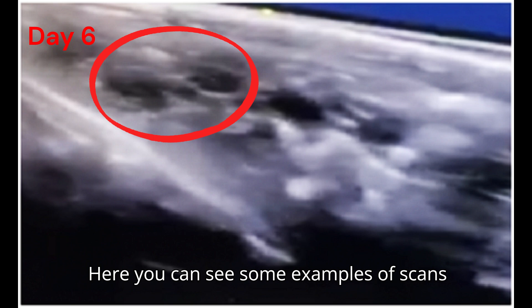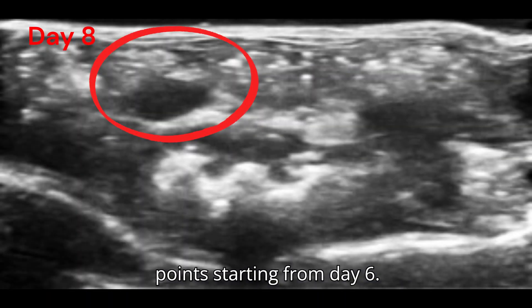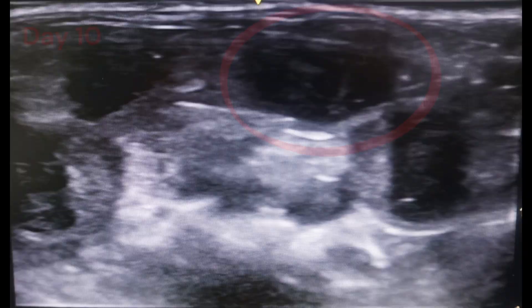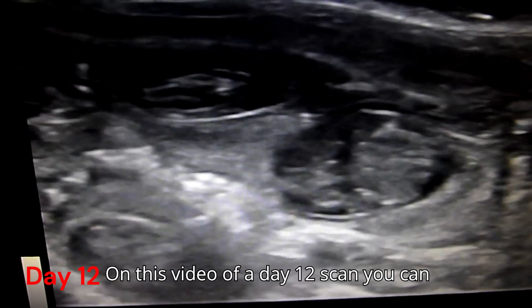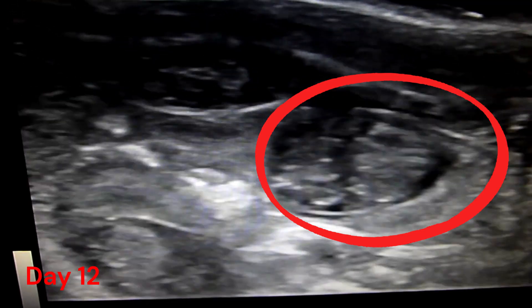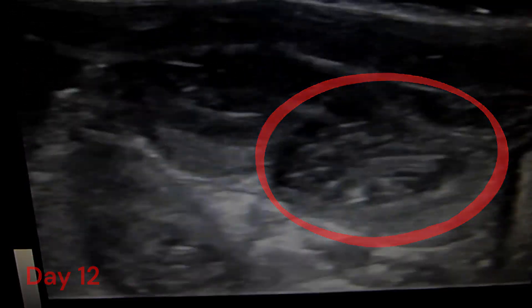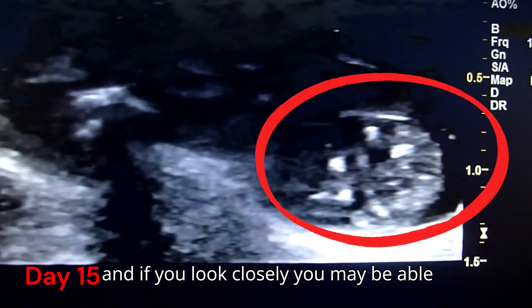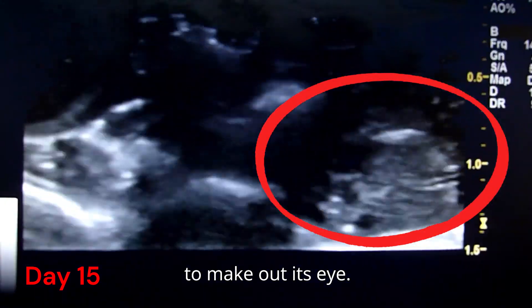Here you can see some examples of scans that we have done at different time points, starting from day six. On this video of a day 12 scan, you can clearly see the pup's heart beating. At day 15, the pup appears fully formed and if you look closely you may be able to make out its eye.